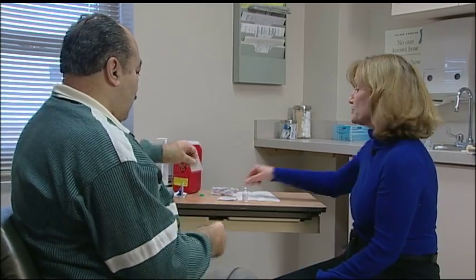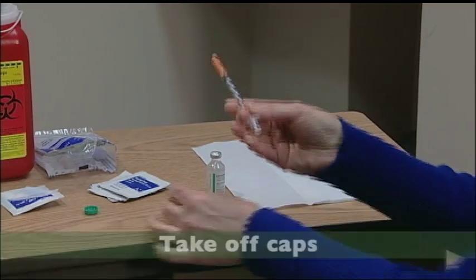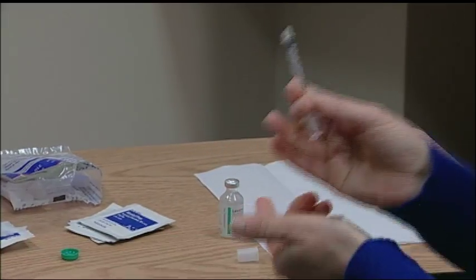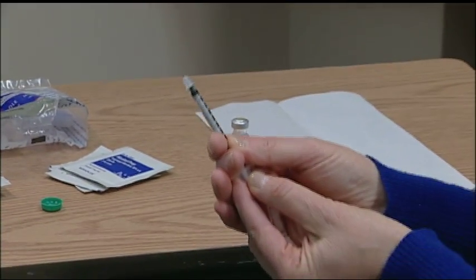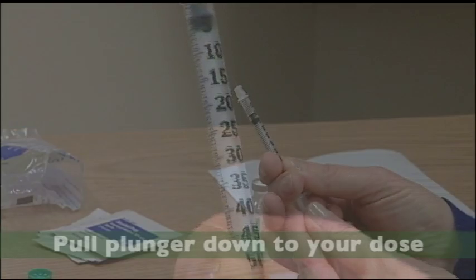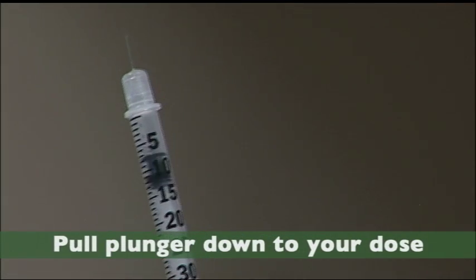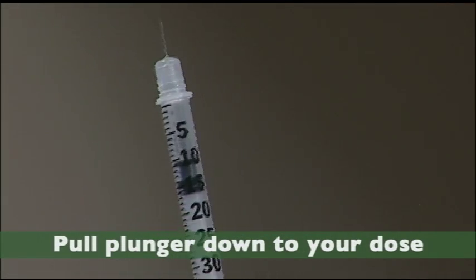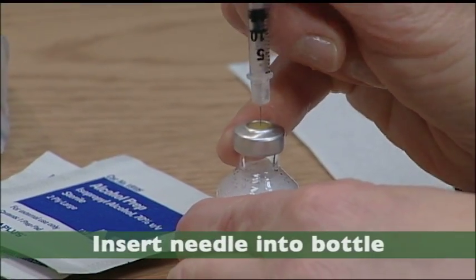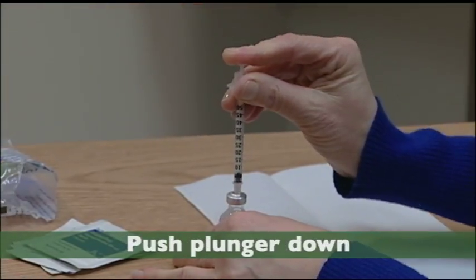Now I'm going to show you how to use a syringe. First, take the caps off. The next step is to inject air into the insulin bottle. Pull the plunger down equal to the dose of insulin you'll be taking — pull it down to 10, which equals the number of units you'll be injecting. Hold the bottle, insert the needle, and push the plunger completely down.